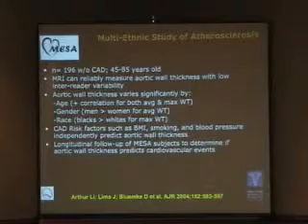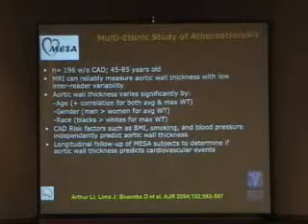Now I just want to mention a couple of other examples of what has been done with magnetic resonance imaging. I know of several trials, and one of them is the Multi-Ethnic Study of Atherosclerosis, an NHLBI-funded, multi-center study. One of the things they are doing is looking at aortic measurement of atherosclerosis.